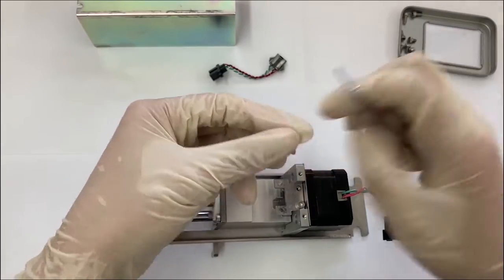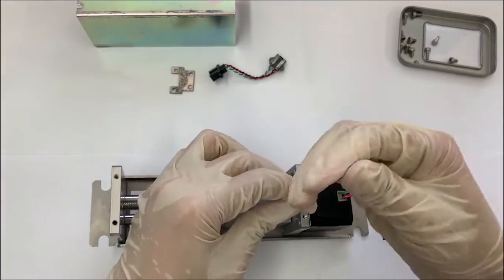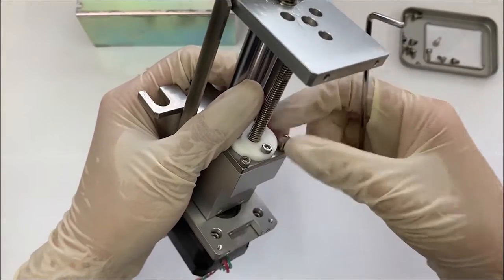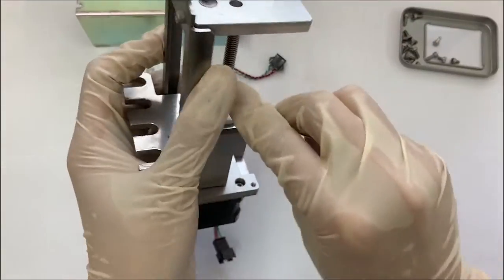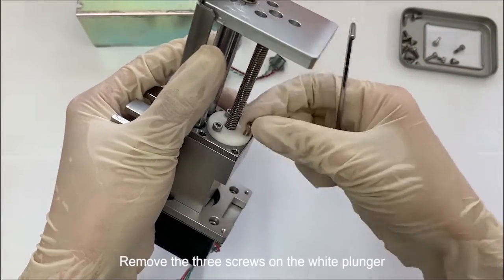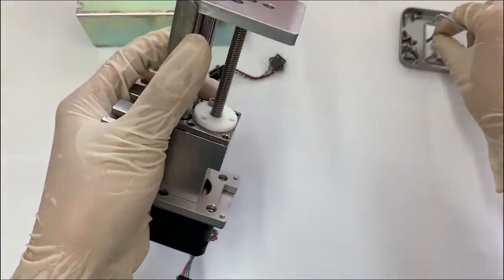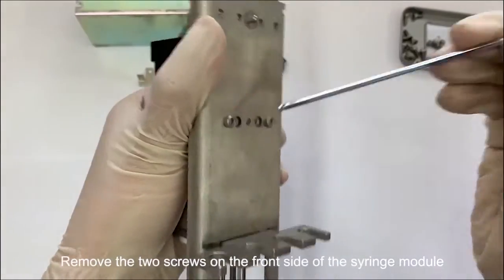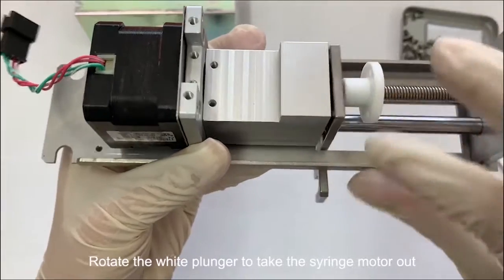Disassemble the small parts. Remove the three screws on the white plunger. Remove the two screws on the front side of the syringe module. Rotate the white plunger to take the syringe motor out.